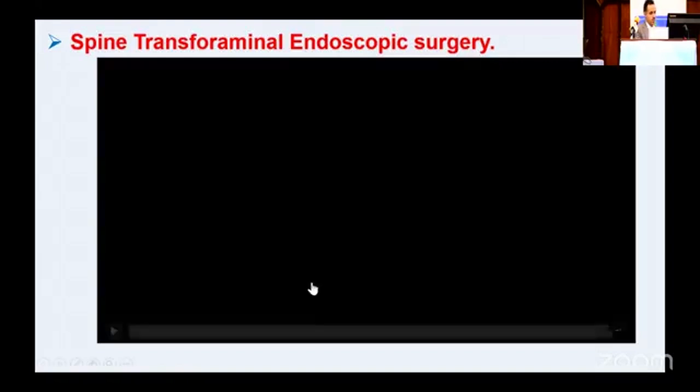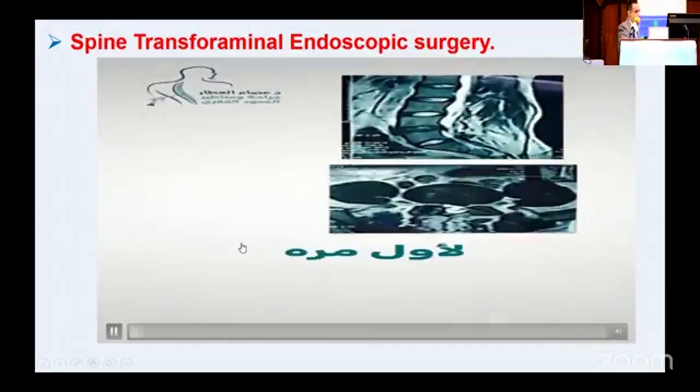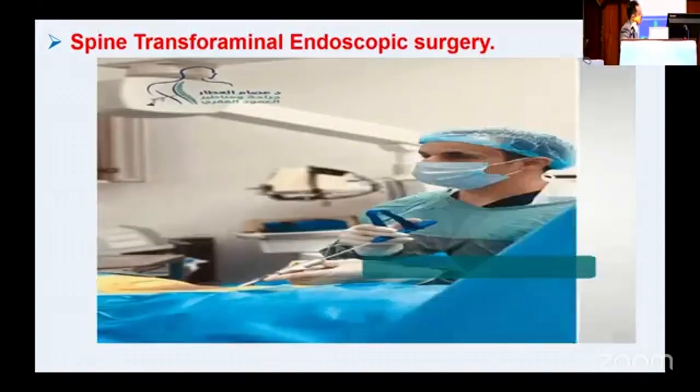This is a brief video to see the transforaminal approach. This is a recurrent disc after open surgery.